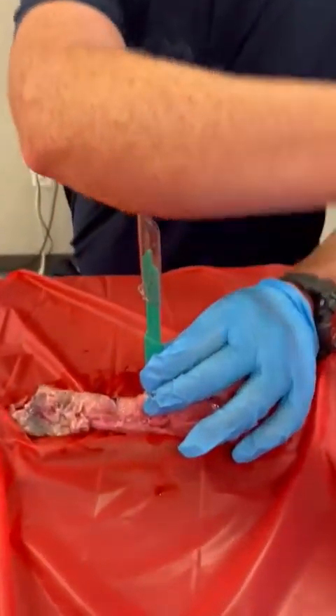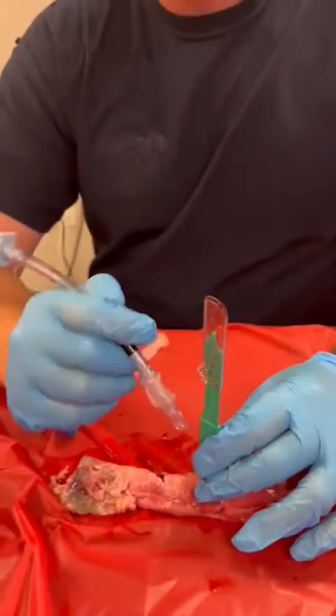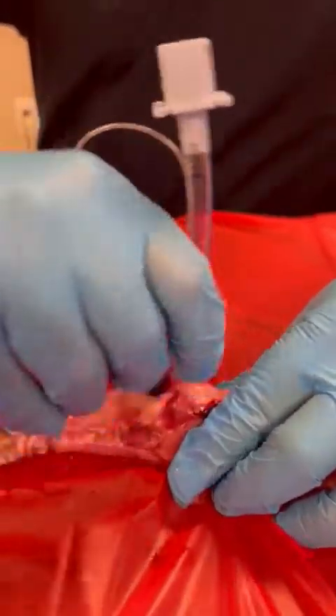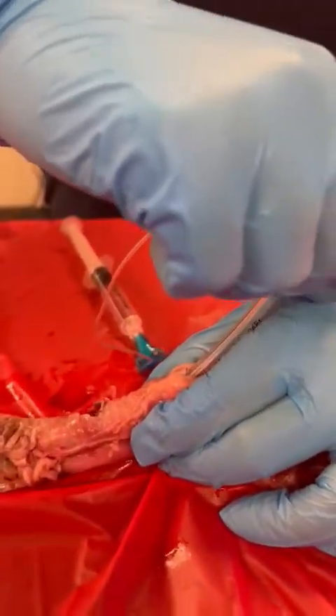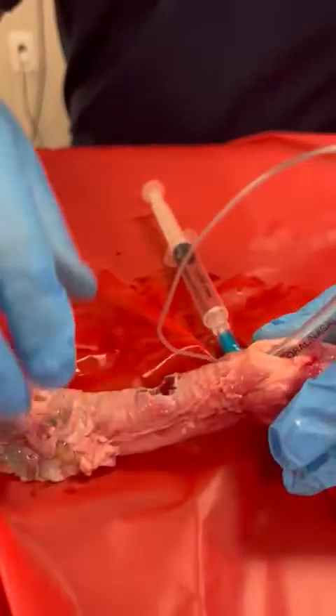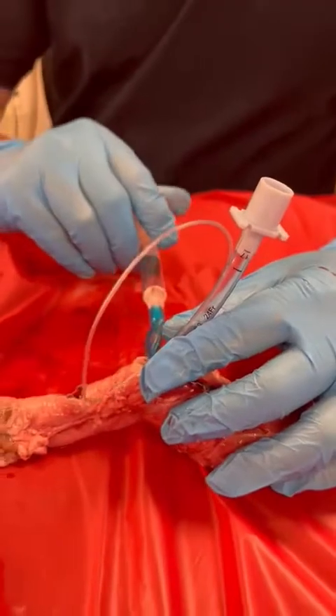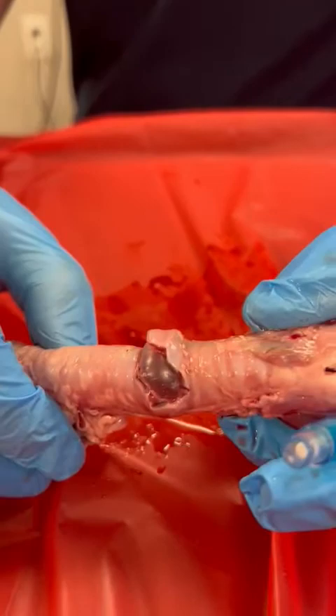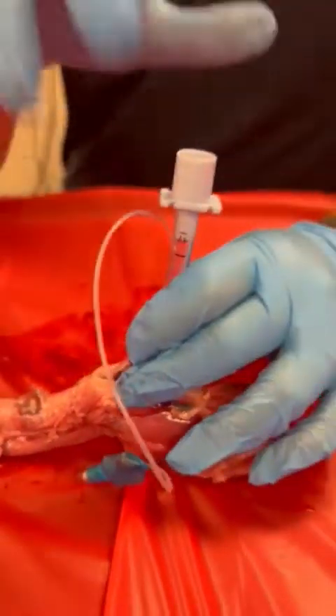Adipose tissue might get in the way — I have friends that have lost this on calls. So you can use your pinky finger, another tool, maybe a hemostat, maybe a trach hook, something that you have with your kit. Now that we have this hole, I'm going to go ahead and grab my size 6-0 tube. It's going to be passed downwards through this hole. Once that's inside, we're going to inflate with our 10 mls. I put it perfectly inside that hole, and now you would go ahead and attempt your ventilations.